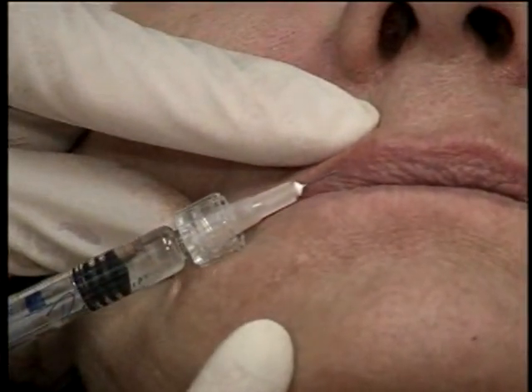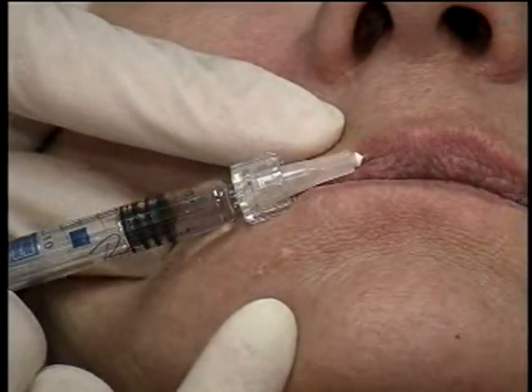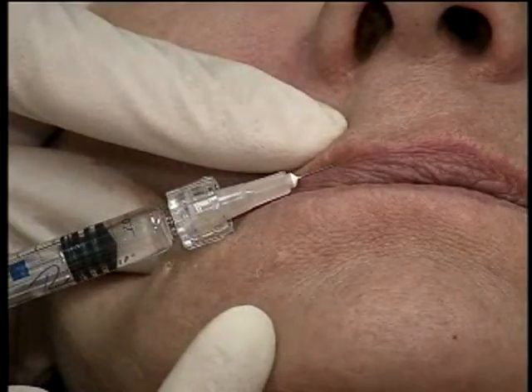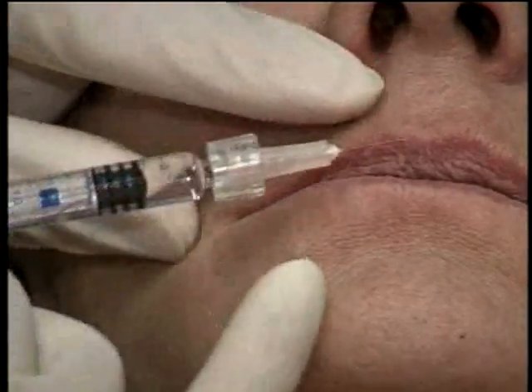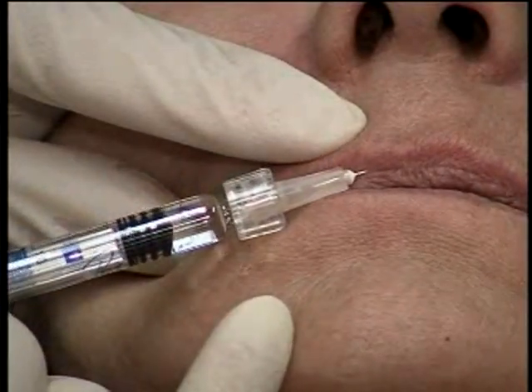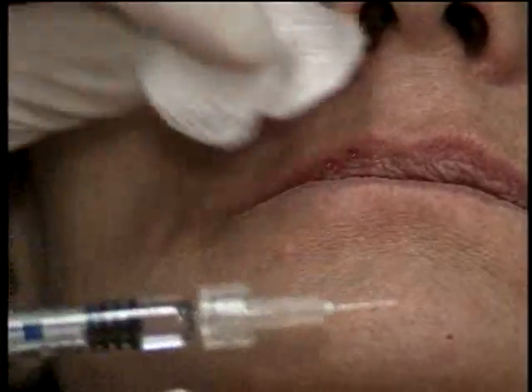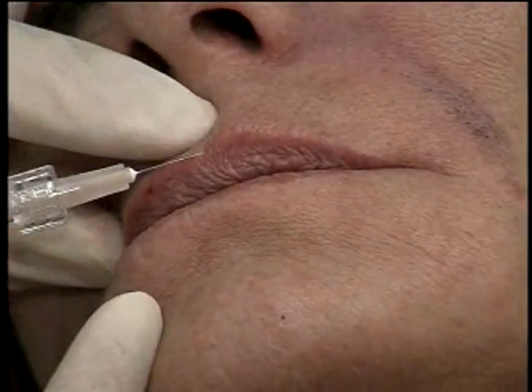I'm just depositing as I move along. So I'm cheating a little bit to the red portion of the lip so that I can rotate the lip out a little bit and up. And it doesn't take much to get a nice result in the lip. Usually I use about a half a cc for the upper lip and a half a cc for the lower lip at most.